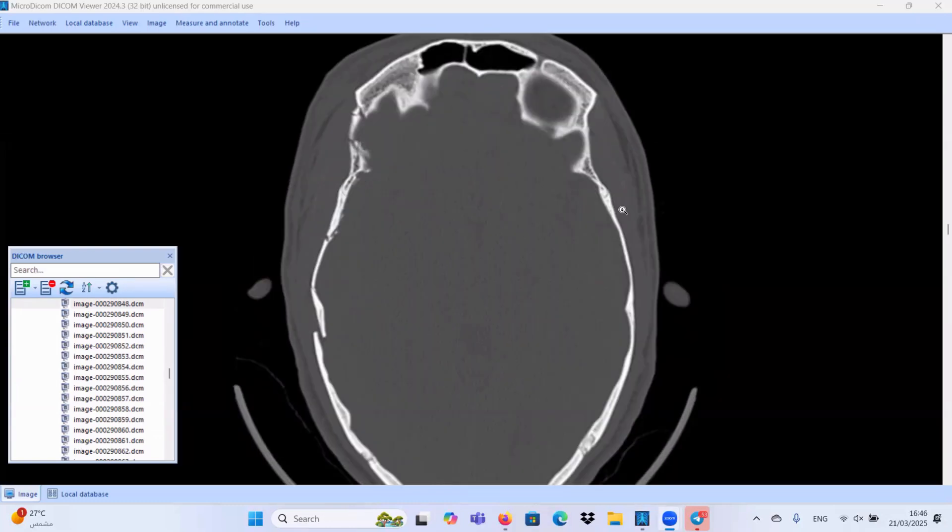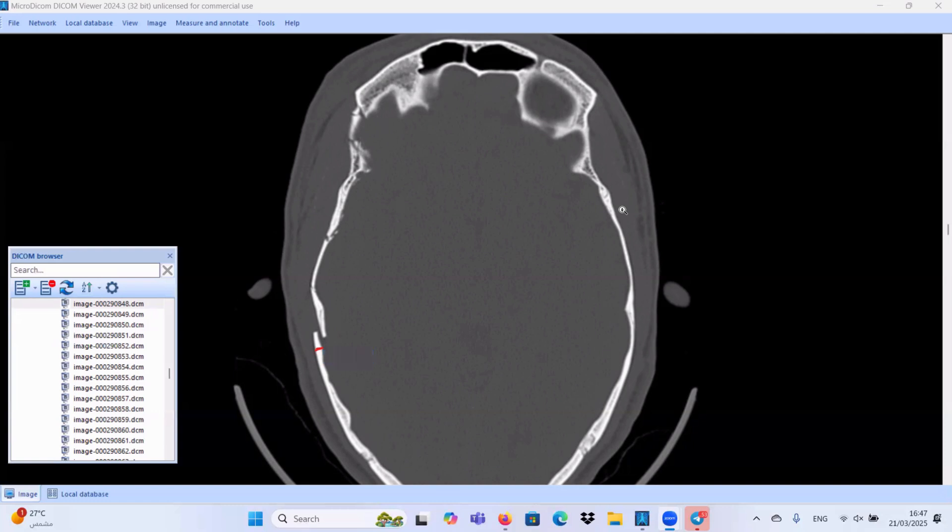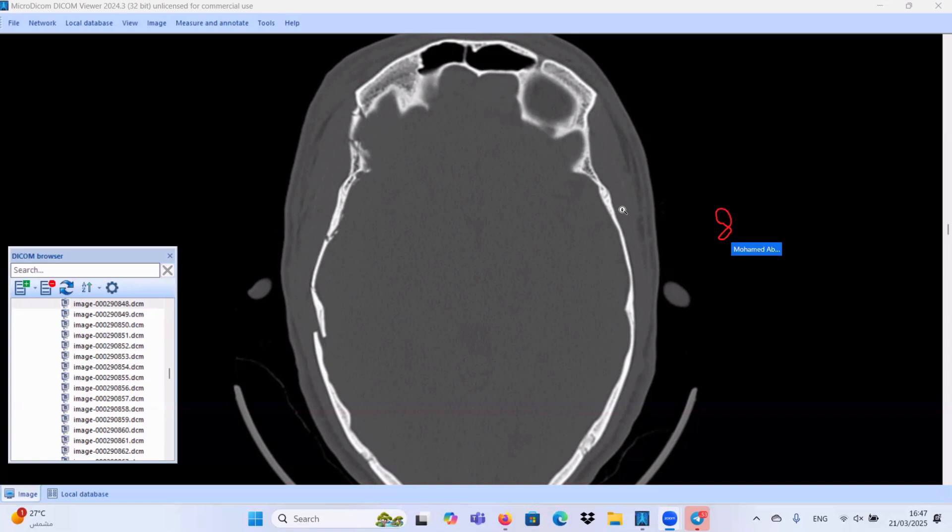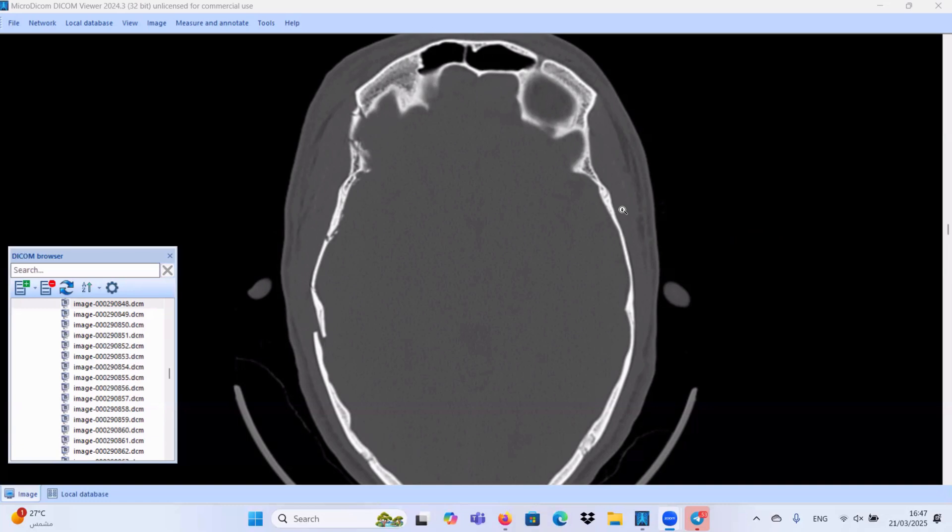The indication of surgery for the depressed bone fracture include if the calvarial bone is depressed more than the whole thickness of the non-depressed calvarial bone. This is one of the potential indications for surgical interference. Also, in some institutes, if the depressed bony segment is depressed more than 8 to 10 millimeter. In our case, it is depressed for about 4.5 millimeter. Also, if we have any focal neurological deficit induced by the depressed bony segment. Those are the main indications for surgical interference.